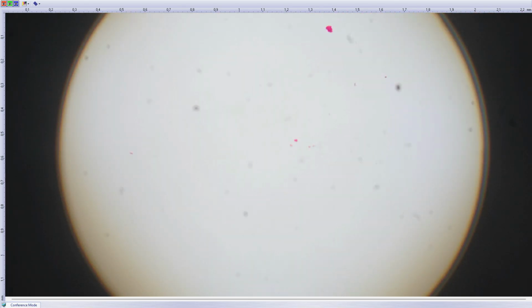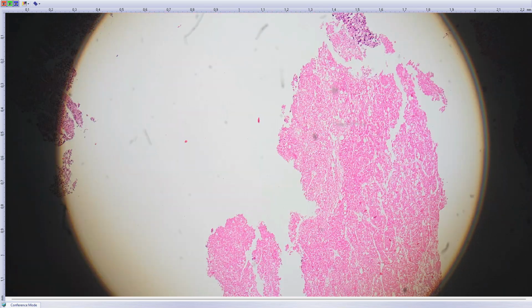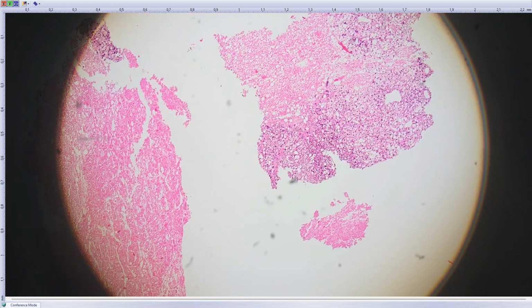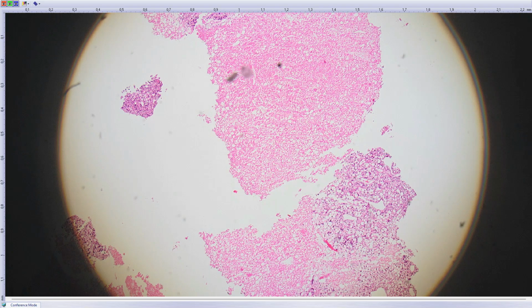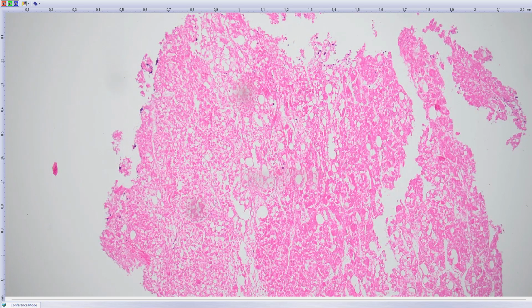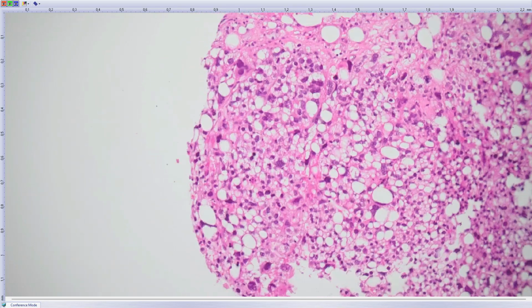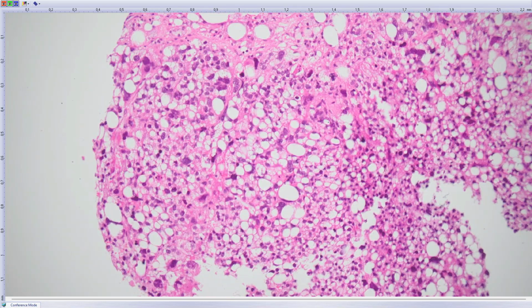Okay, look at another soft tissue case, quite interesting. Again, it came as a consultation, and this older lady had a tumor in the S1, S2 segments of the vertebral column. So some bone was probably destroyed, and you can see this necrotic tumorous mass showing this morphology. And this is basically an H&E diagnosis.